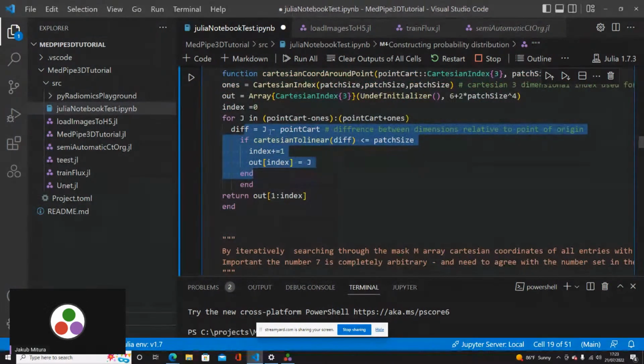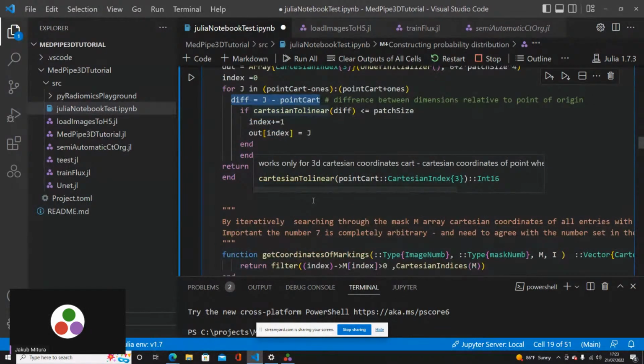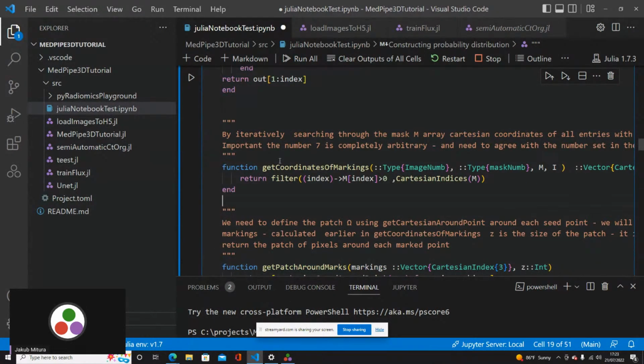But here we are just choosing the Cartesian indexes that are within the distance from the center voxel. Here we are filtering from the array that we annotated all of the indexes that have values bigger than 0.